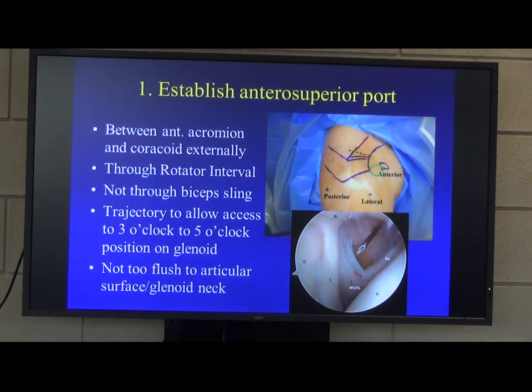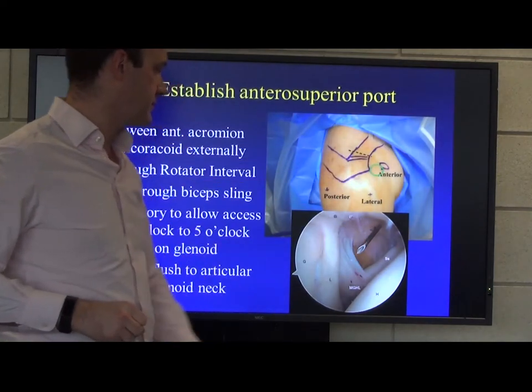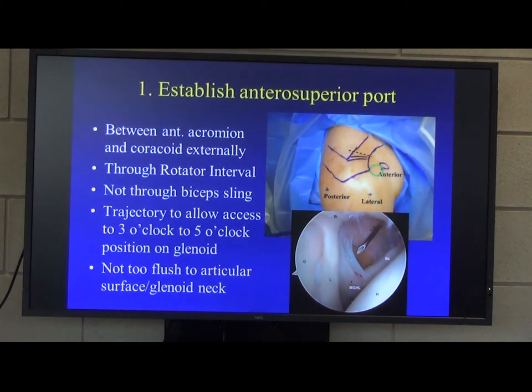Once you've got your scope in and you're about to start, you establish an anterior superior port somewhere between the coracoid and the anterior border of the acromion. Use a needle to guide yourself in, and try to get it through the middle of the rotator interval. Try to avoid the bicep sling — if you damage that, they can develop bicep symptoms afterwards. You want to make sure you have a trajectory that goes down onto the glenoid between about 3 and 5 o'clock, and come in at about 45 degrees rather than too flush to the articular surface.